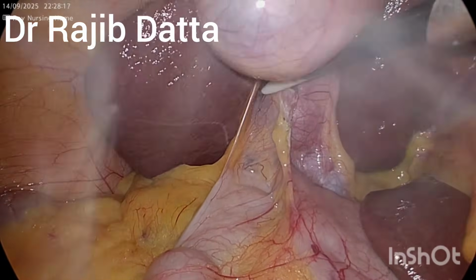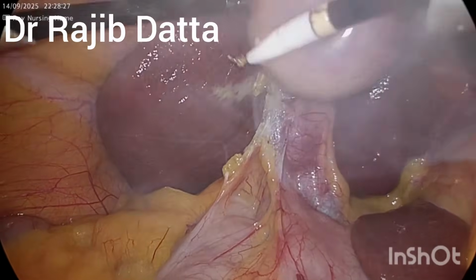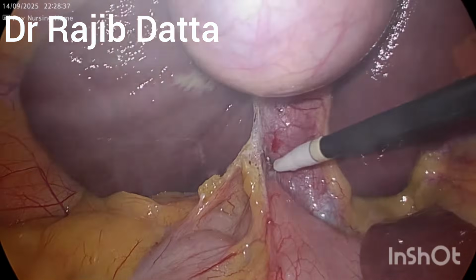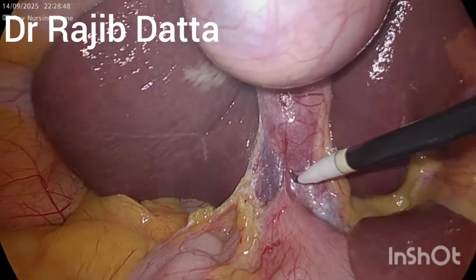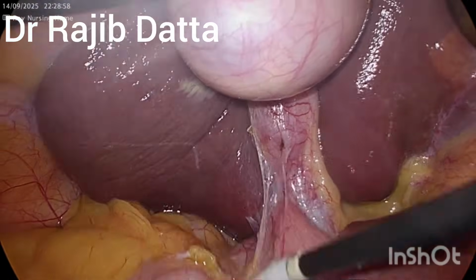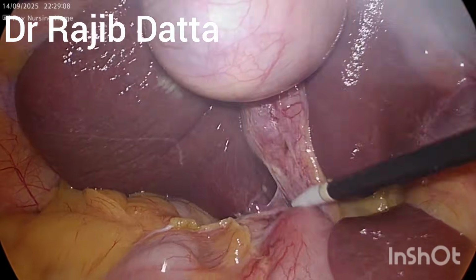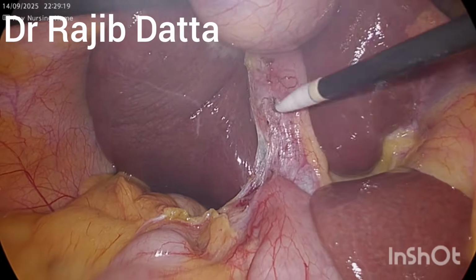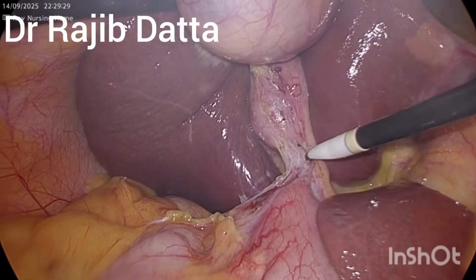Small bursts, and the diathermy voltage remains at 25 watts. Small bursts are the main key for proper adhesiolysis. Now we are just separating the stomach from the gallbladder and the CBD. So our target is to visualize the cystic pedicle. Small bursts are going on.